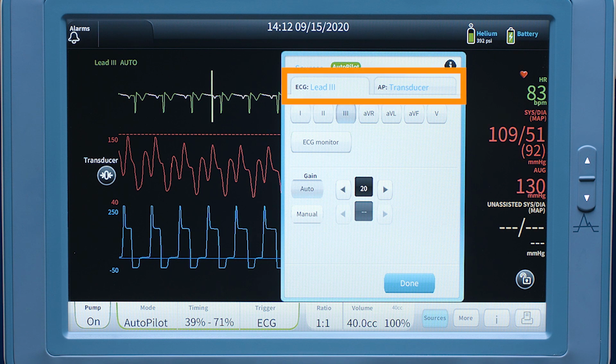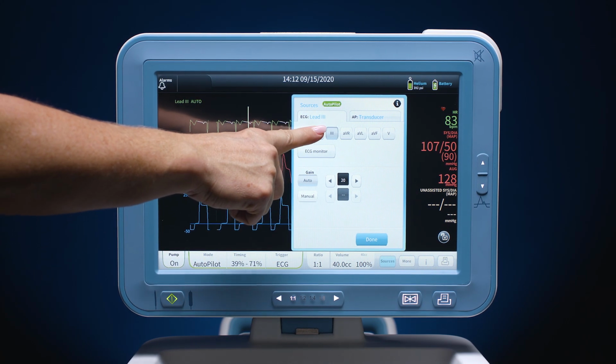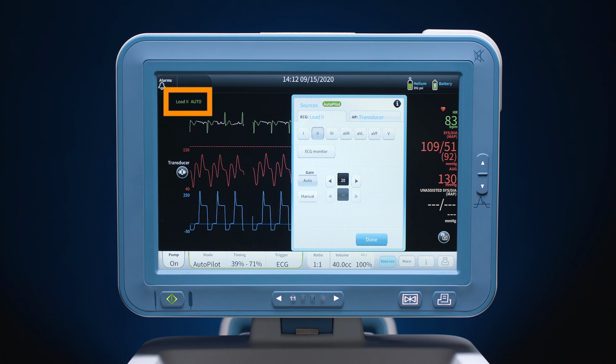Note, the menu displayed when touching the ECG waveform has 2 tabs. One tab is for the ECG function and the second tab is for arterial pressure function. Select the desired lead from the options presented. The new selection will be displayed.